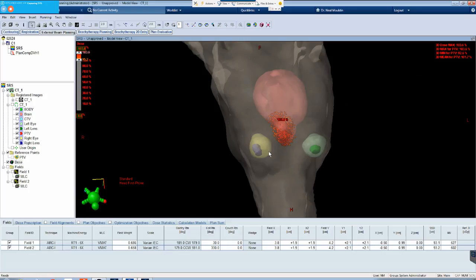As I said, for tumors in more dangerous parts of the brain, for spinal tumors where we have very little room for error, the capacity to deliver our prescribed radiation dose in arc fields is a very important component of treatment.